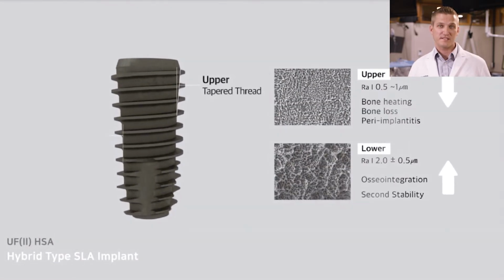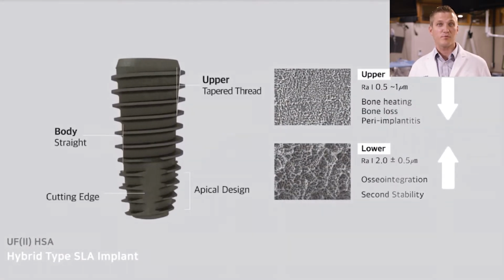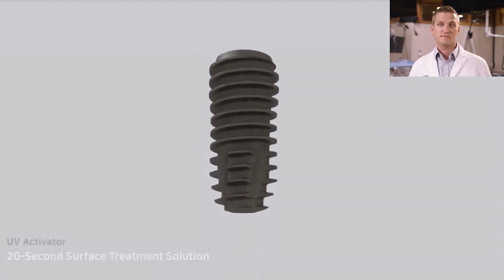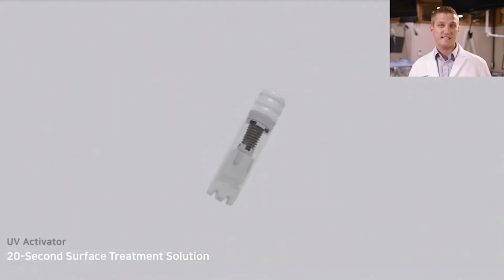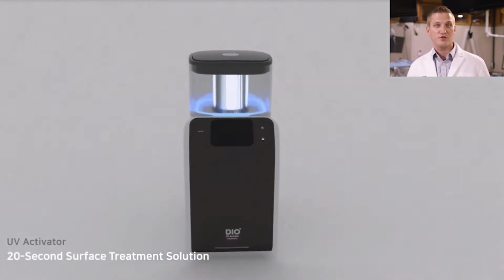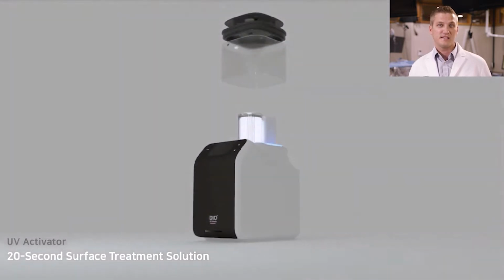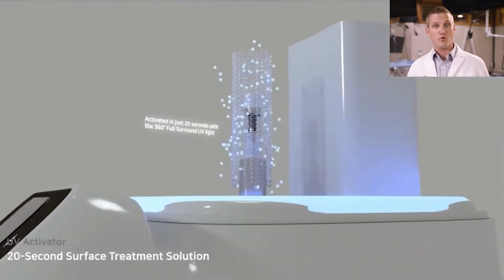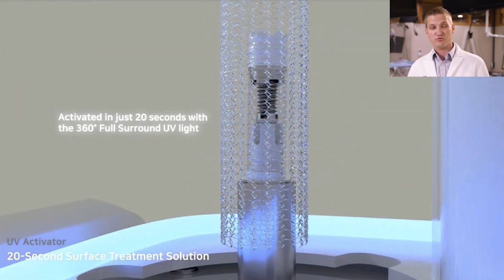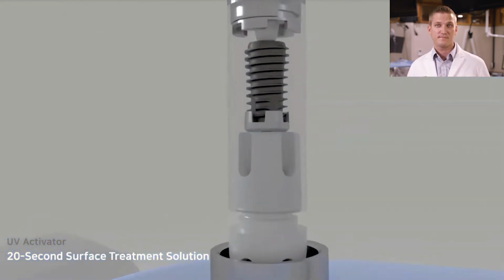Their implant surface, the most contemporary implant surface on the market. And now you're going to see that implant be supercharged, so to speak, with the chair-side UV activation process. This is going to enable the implant to be even more hydrophilic, lending itself to faster healing time and a stronger implant at the end of the day.